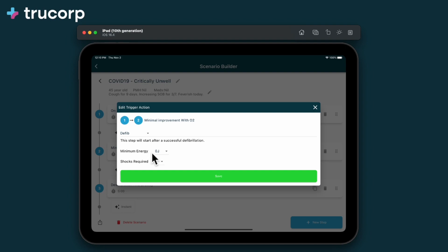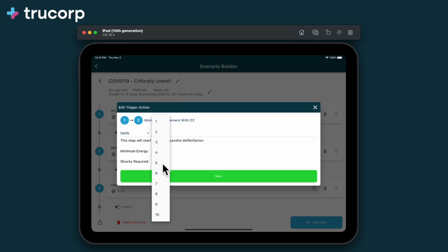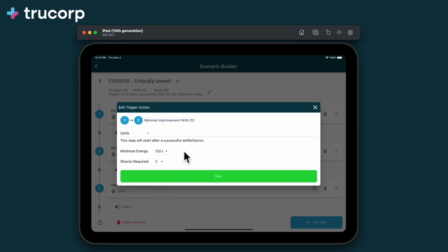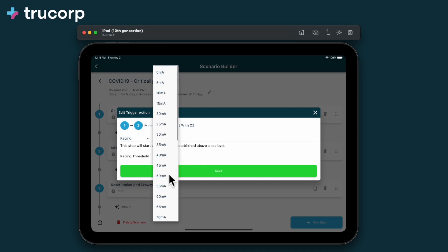Defibrillation, where the next step is triggered after a specified energy and number of shocks are delivered. And pacing, where the step continues after pacing is achieved above a specified threshold.